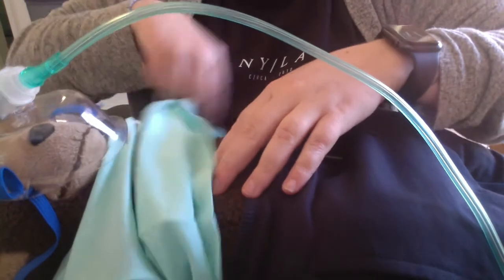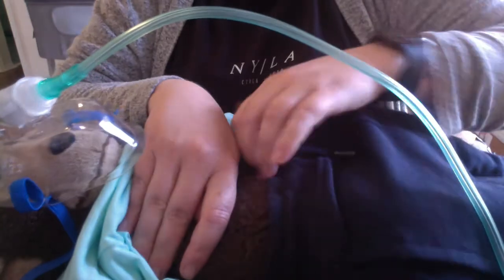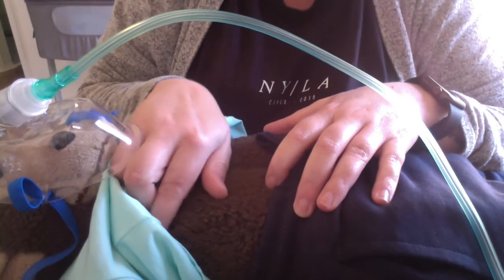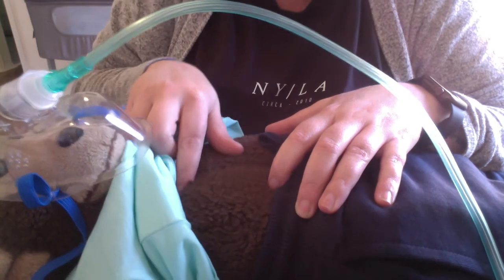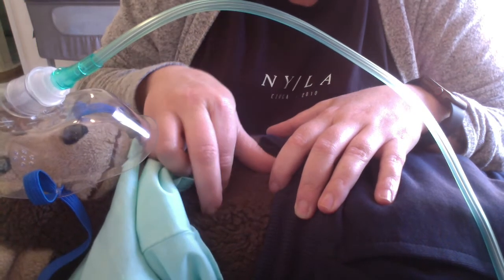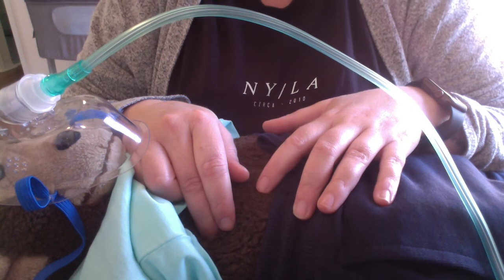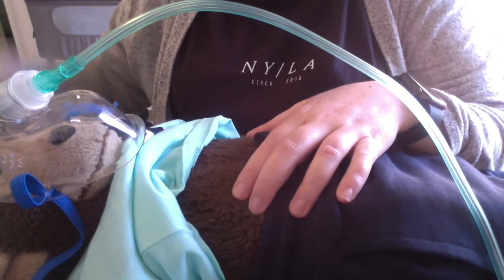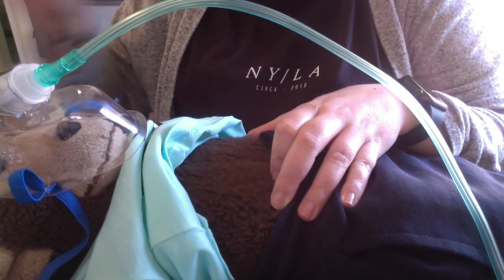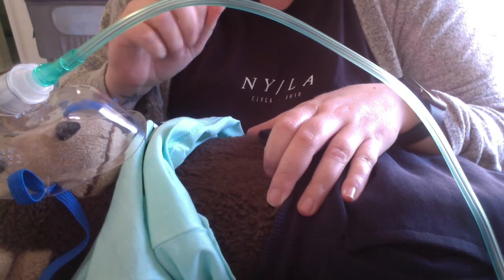In a trauma situation, these clothes would be cut off so that we could access the site. We then want to identify the second intercostal space. So second intercostal space and then mid-clavicular line. So around there. We then want to swab the site once we've identified it using aseptic techniques, making sure that we do not retouch the site after it's been cleaned.